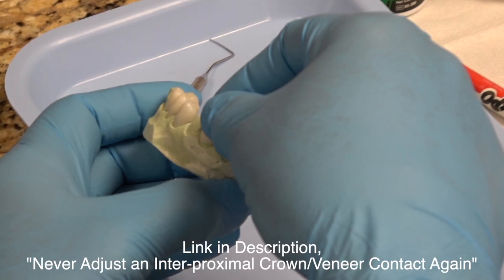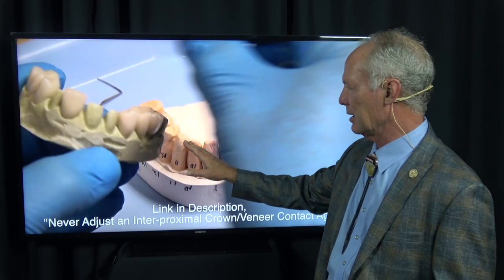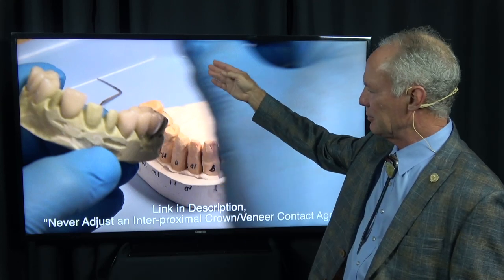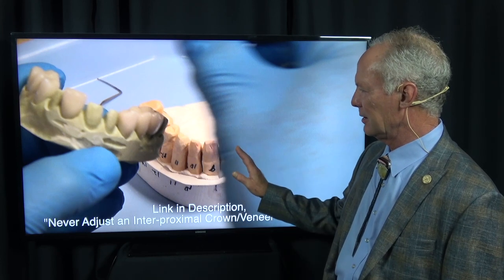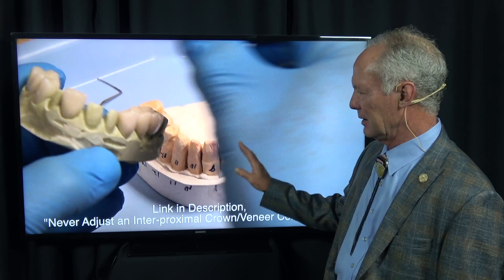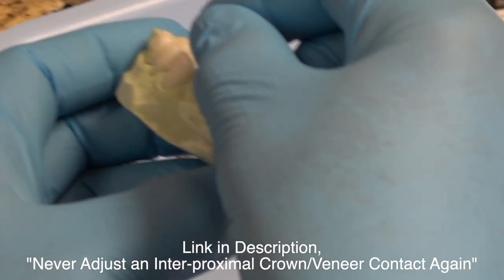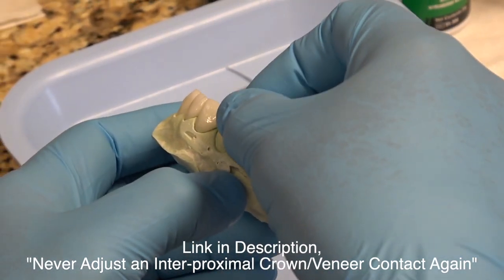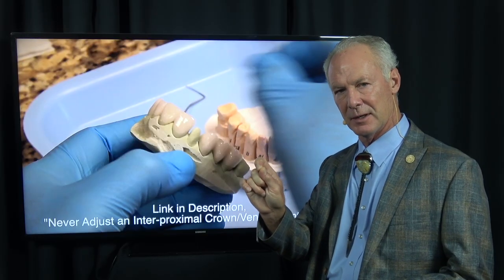The first thing we're doing - this is a solid model. Always use a solid model when you're fabricating crowns, inlays, or veneers. That lets you perfect the interproximal contact. I rarely have to adjust an interproximal contact, and if I do, it's a very light adjustment with maybe a rubber wheel. You can't perfect interproximal contacts on a die model.